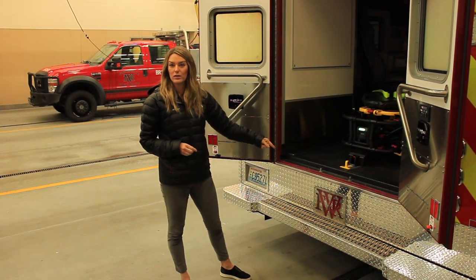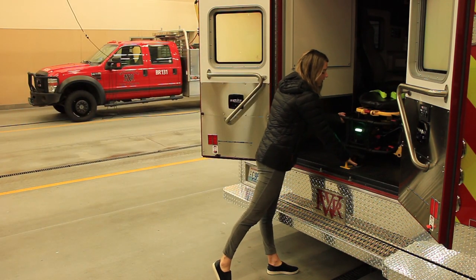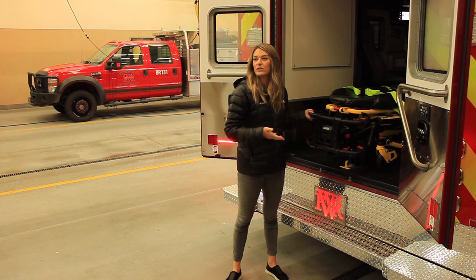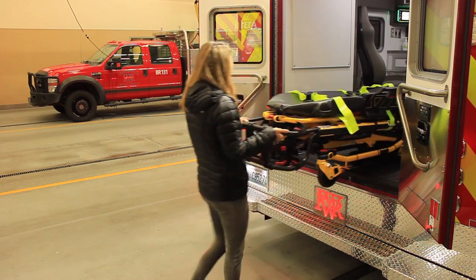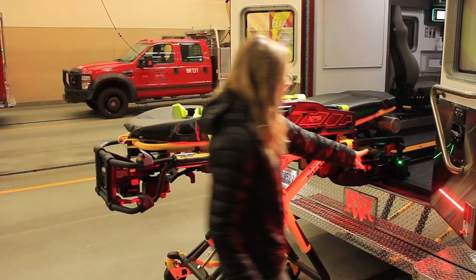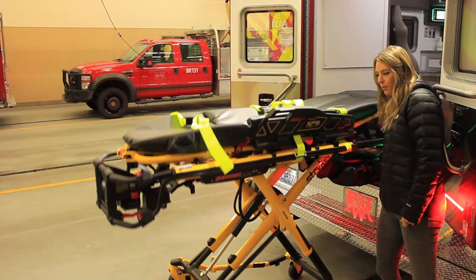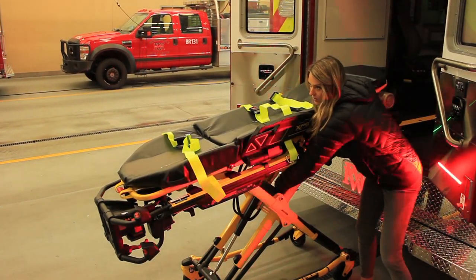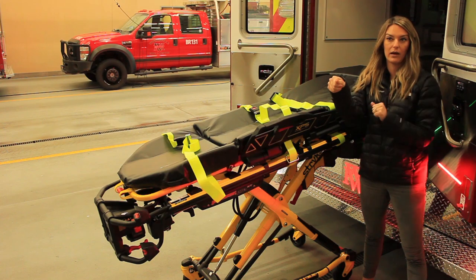Now let's say the power load system died — something went completely wrong. You'll know right away because if it's dead, it's not going to raise up. You'll get used to it raising every time, so if it doesn't, something's wrong. Bring it all the way out, then pull the manual release. This is when you use the dump button — the far button on the right. What this does is it lets the hydraulics out of the lifting arms. Press the button and reach to pull the arms down manually. So for any reason you can't get these to come down, press the button and pull them down.